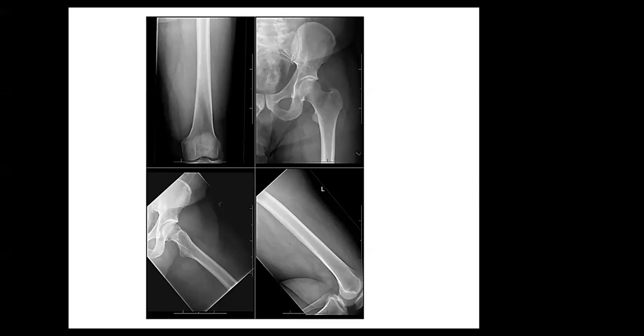Tumor or benign lesion. Yeah, you're right. I mean, myositis ossificans will have a different type of calcification compared to dermatomyositis. But when it comes to soft tissue sarcoma, how is it useful to us that we know whether the tumor has amorphous calcification or not?